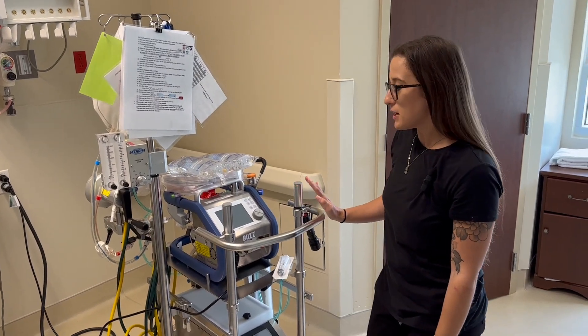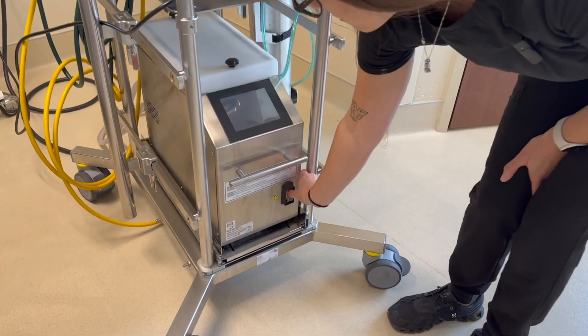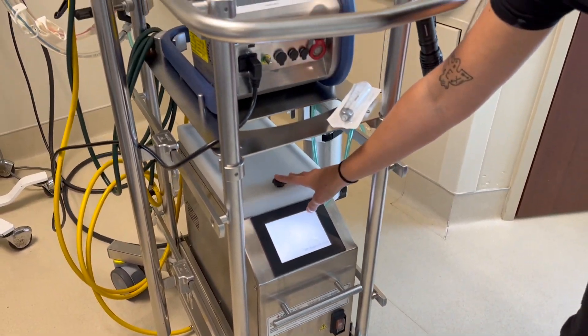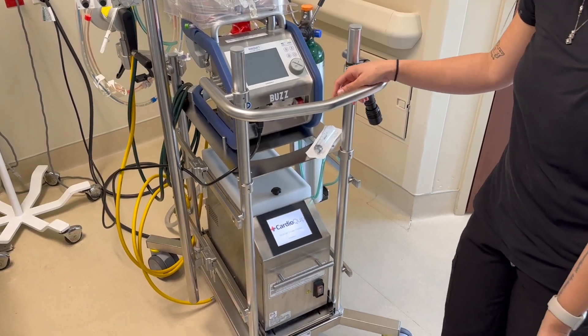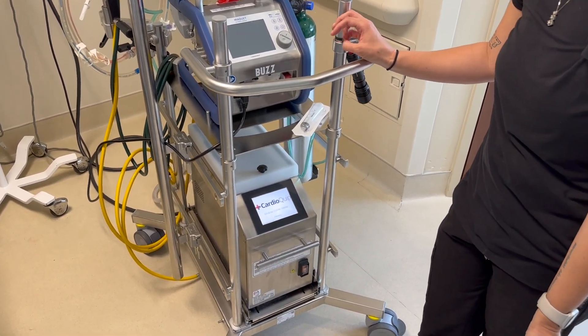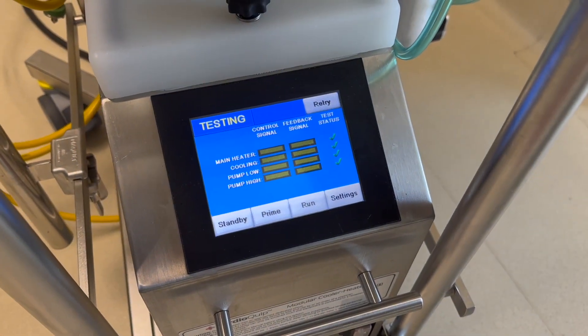First thing you're going to do is plug it in and turn on your heater cooler. You want to make sure you have filled up your heater cooler with sterile water. Once your heater cooler turns on, you're going to set it to prime and hit prime.